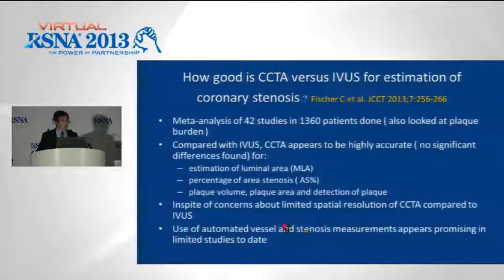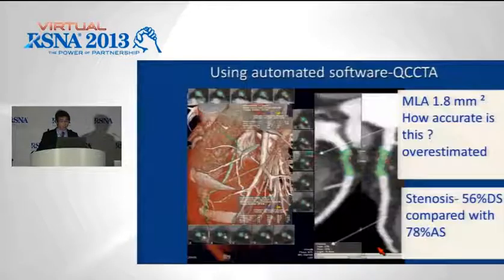This is in spite of concerns about the limited spatial resolution of CT compared to IVUS. Maybe the spatial resolution of CT is good enough for this sort of analysis. And using automated vessel and stenosis measurement software appears promising in the few limited studies that have been performed.